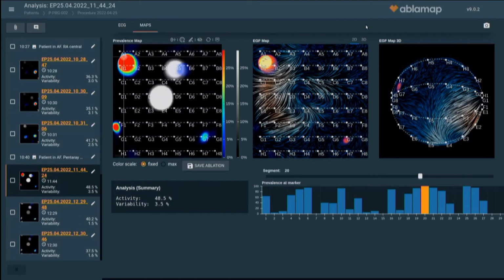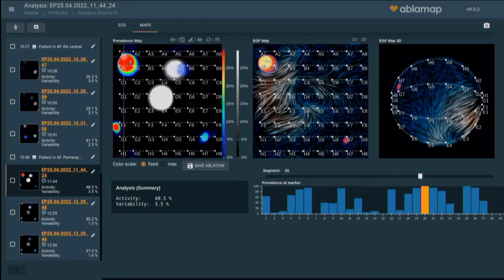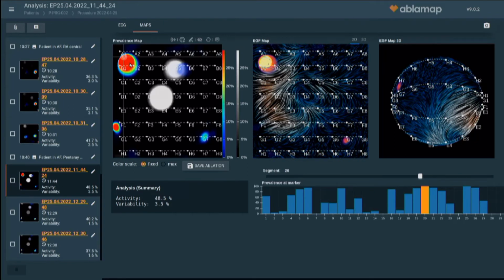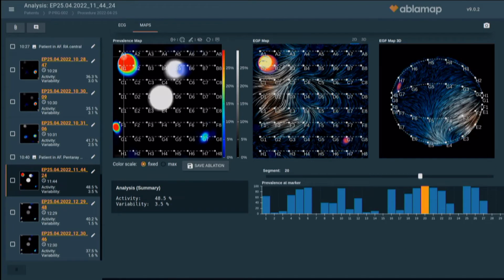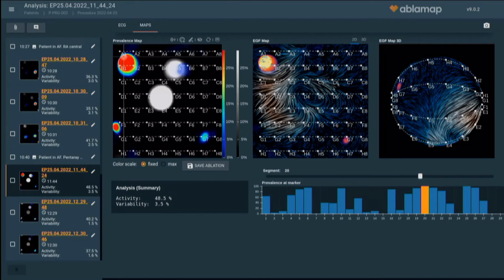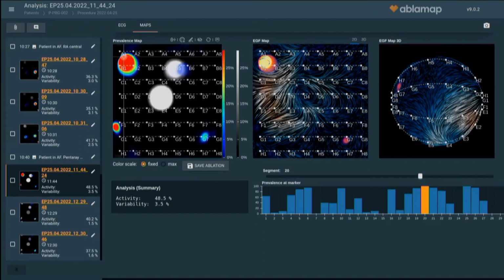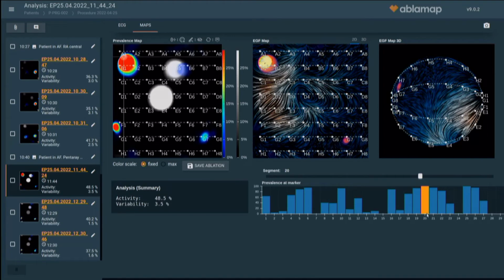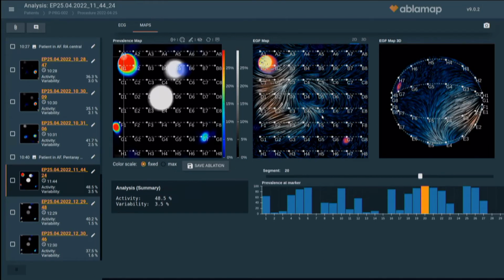Okay. So just before you guys came on, we put the basket in the left atrium, and this is what we saw. So if you look at this map, can you show them this? Let's look at this one right here, the middle one. That's just one of the 2 seconds. If you look on the bottom right here, this orange segment is one of the 2 segments. So when we click on this, we see that. Let's click on another one.